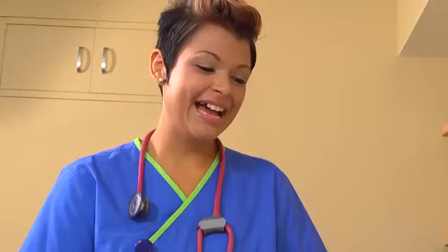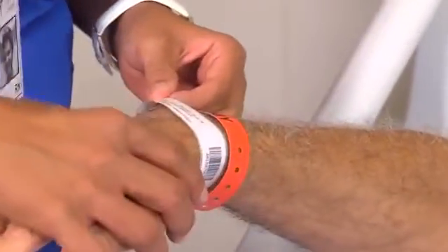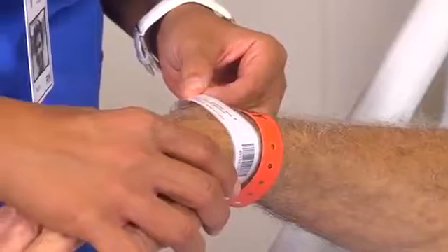Hi, Mr. Davis. I'm Nikki and I'm going to be your nurse. First off, I want to take a look at your hospital ID bracelet, okay? Can you tell me your name and date of birth? Bill Davis, December 25th, 1929.